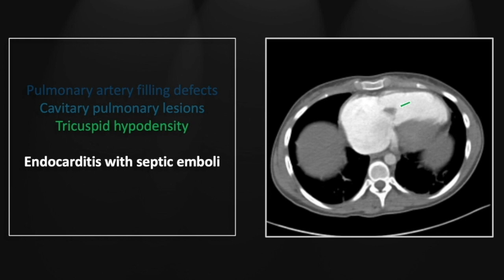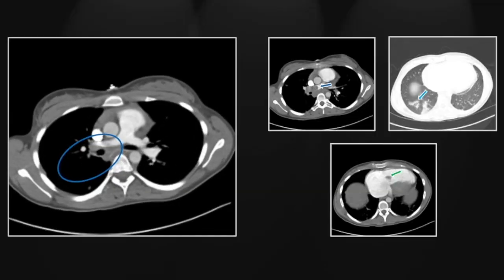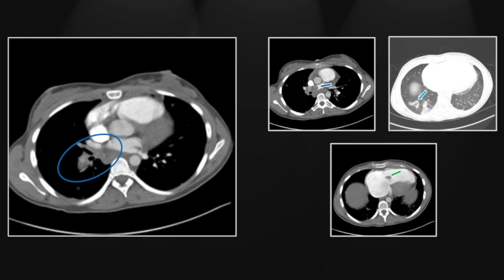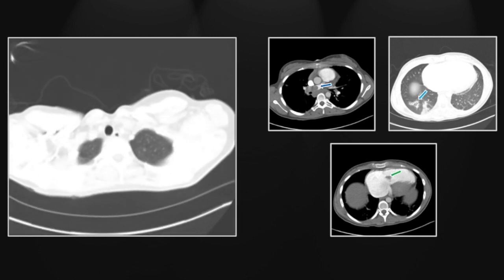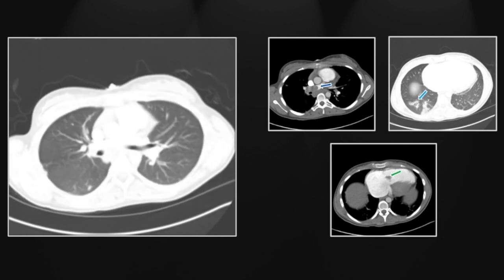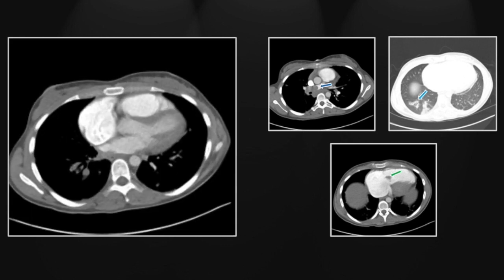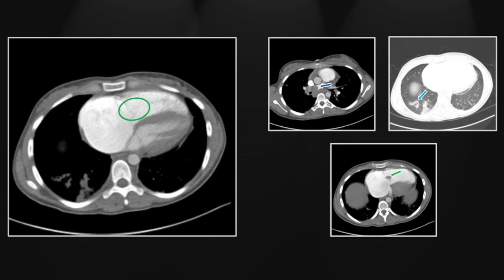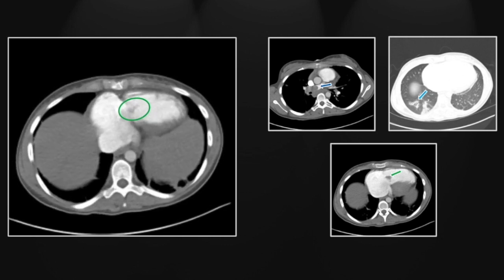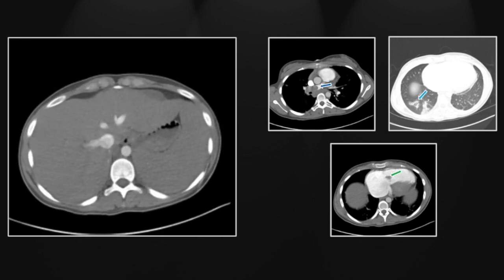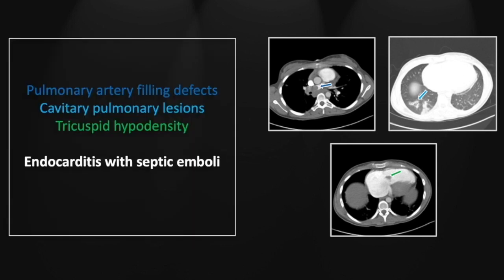There is a sizable vegetation on the tricuspid valve. Note also marked right atrial enlargement, consistent with valvular incompetence. The filling defect is again seen in the right pulmonary artery extending down into the lower lobe. On lung windows, there are multiple cavitary lesions, most notably in the right lower lobe, and this rather striking vegetation on the tricuspid valve. Hepatic venous and IVC backflow is also visible, consistent with valvular incompetence.